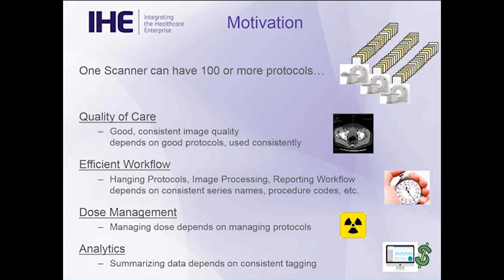And finally, if you're doing analytics, if you're trying to track what your turnaround times are, if you're looking at your throughput, and a lot of this has dollar implications, it's very difficult to do good data analysis unless things are properly tagged and labeled, and a lot of that is involved with protocol parameters.